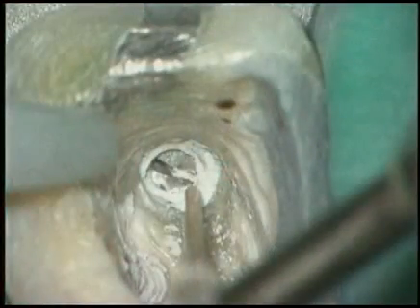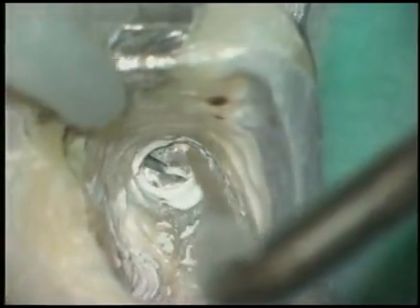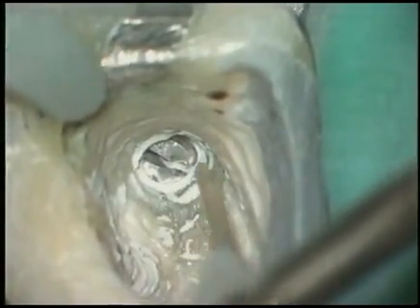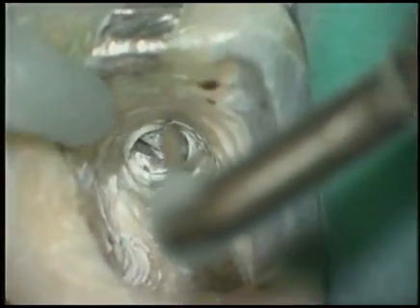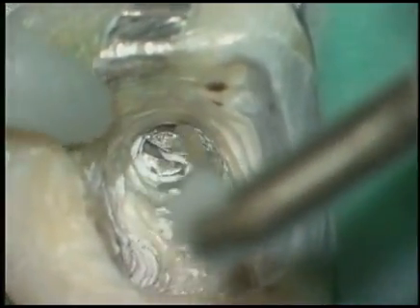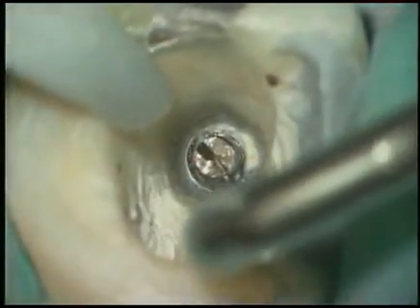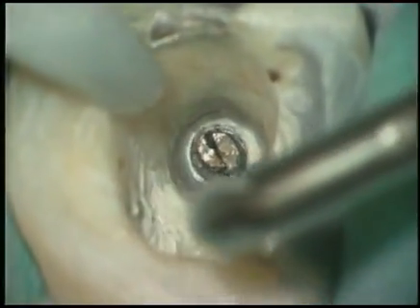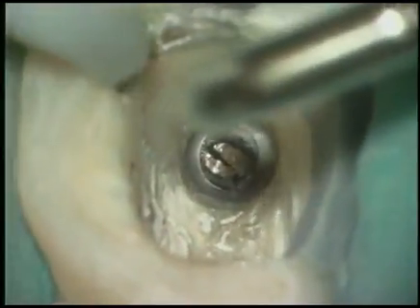Well, the post just sheared off and is broken for a second time. You can see then that we need to really be resilient to these setbacks and again have a fallback position. Fortunately, with the microscope and at high power, I'm looking to about mid-root in the palatal canal. There's a little movement. It's quite encouraging after a few setbacks to see that with a little bit of patience and determination, usually we can be successful.